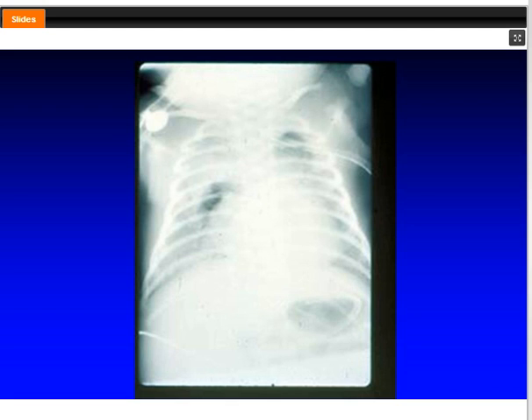And this is a good example. On the right side of the chest, you have a pneumomediastinum. You have a very small right pneumothorax. On the left side, you have a chest tube and a left pneumothorax. But the overall inflation of the lung is very poor. And therefore, you are going to need more mean airway pressure to get this lung inflated. But once it inflates, you need to make sure that you back off on that mean airway pressure.